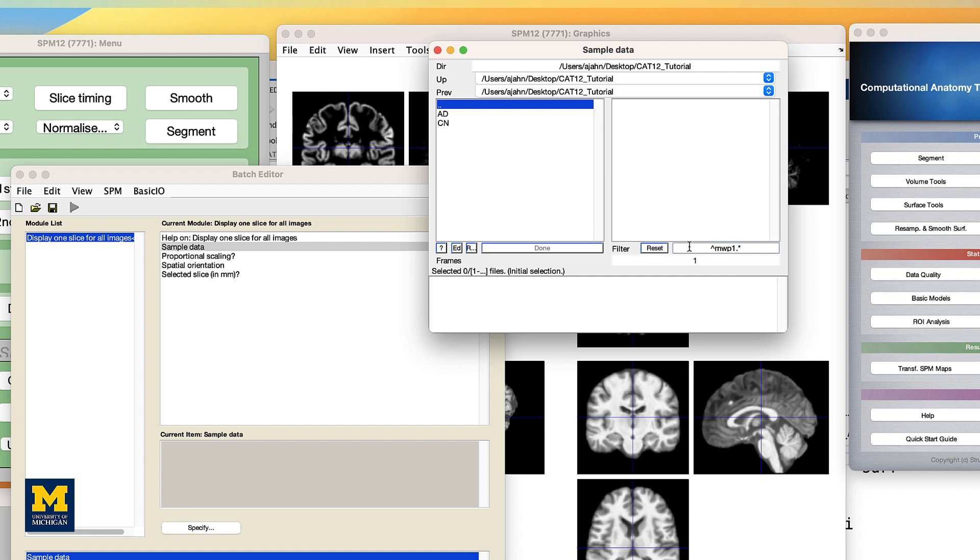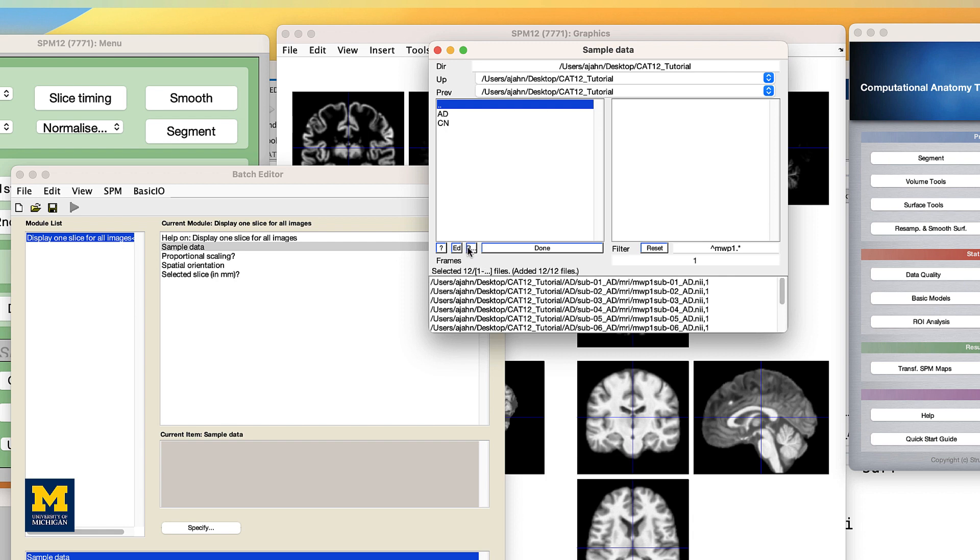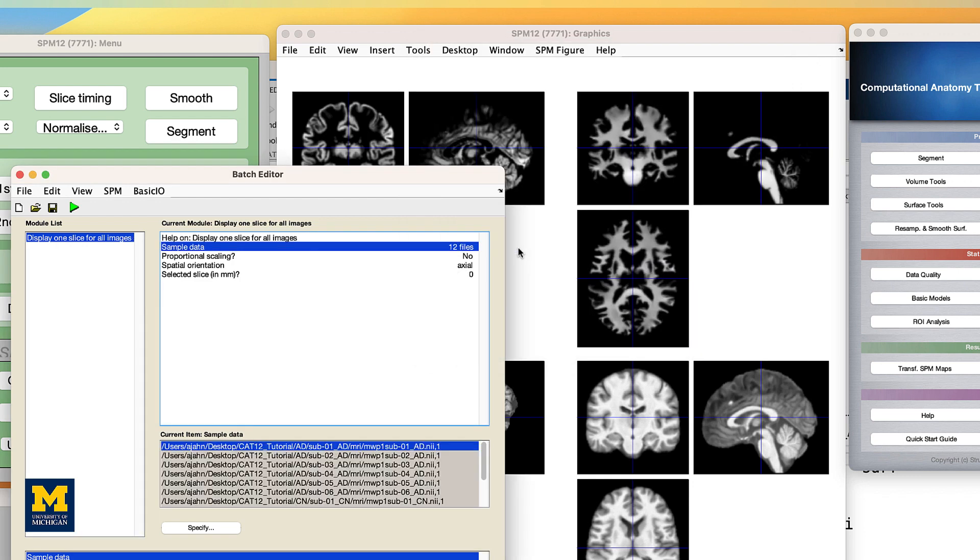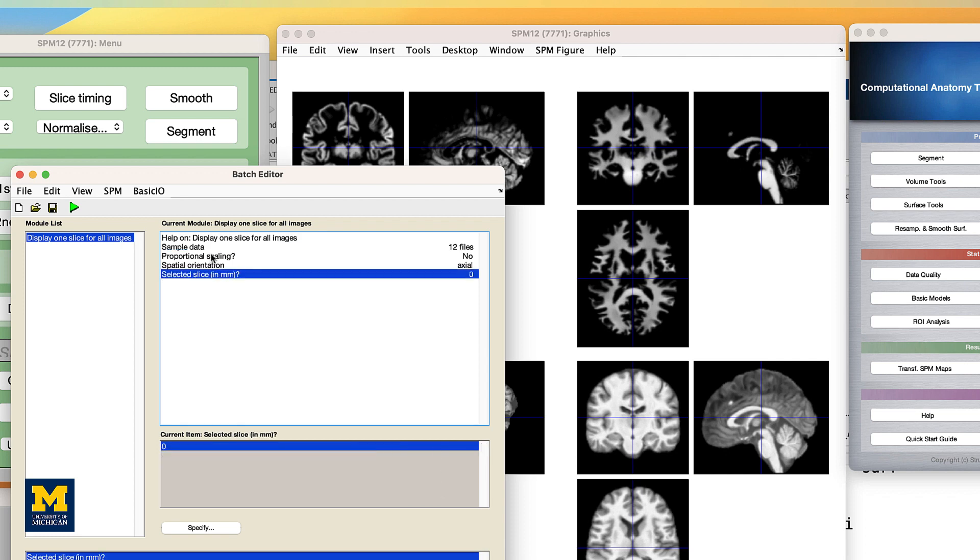In the filter field, enter the string MWP1, and then click the rec button. It's difficult to see in the following figure, but it's the one next to the add button. Click done, and then notice you can choose any slice you want and any orientation you want. The defaults are slice 0 and axial, which will display an axial slice that crosses through the anterior commissure.